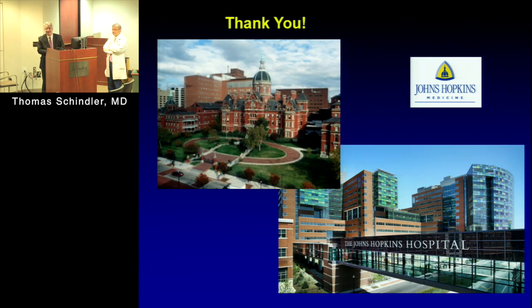And I was thinking about sarcoidosis. Yeah. You're right. The FDG is a non-specific radiotracer. As I said, I could also argue sometimes it could be myocarditis, could also be postpartum cardiomyopathy. And that's why you need the clinical information and the uptake pattern, the mismatch between perfusion and FDG. And sometimes it's a very controversial discussion. So we would be happy if we had a specific radiotracer for the granuloma.